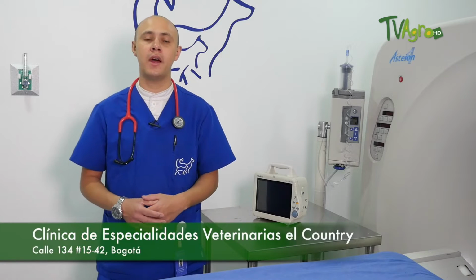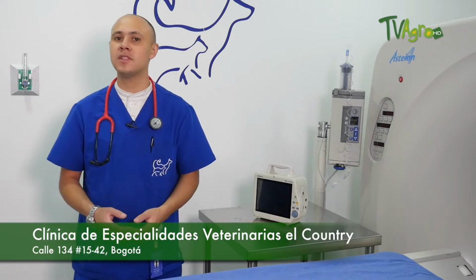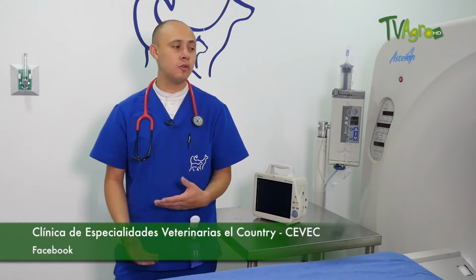Greetings, I'm Edwin Hernandez, anesthesiologist veterinarian and in charge of the tomography part of the veterinary specialties clinic of the country. Today we will talk about veterinary tomography. The idea is that we learn when to submit a study, what to use a study for, in which cases it should be requested, how to handle the patient, at what times we should take it and how we should transport the patient to the clinic.